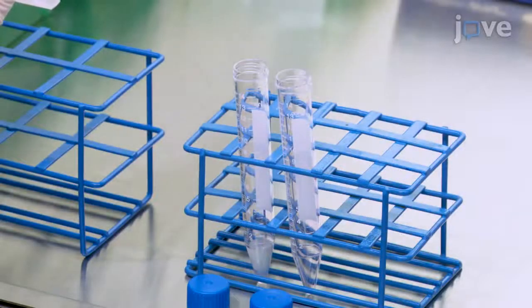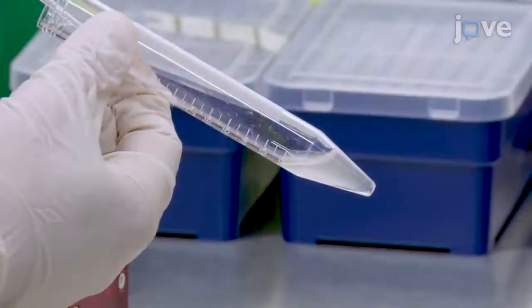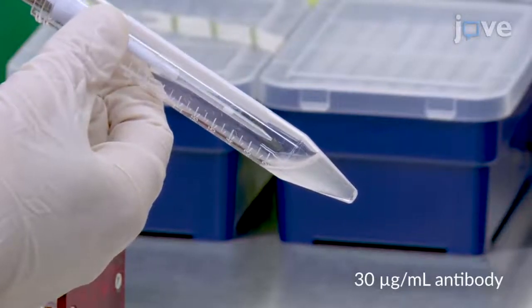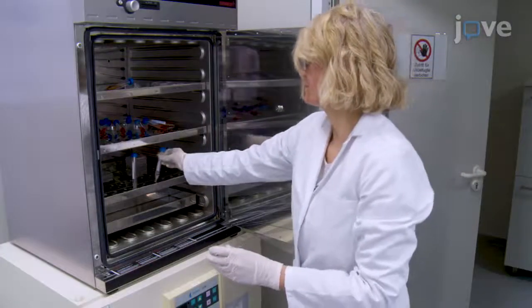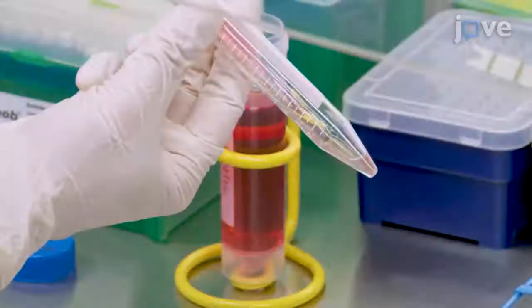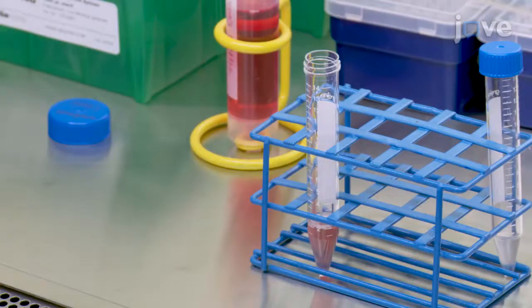Add 6 × 10^6 mononuclear cells to a 15 milliliter tube, then perform antibody cross-linking by adding human GPI-linked membrane protein-specific antibody to the cells in PBS with 1% BSA, and incubate for 30 minutes at 37 degrees Celsius. After the cross-linking, replace the incubation medium with ISCOV's Modified Dulbecco's Medium supplemented with 10% FBS, and grow the cells in a 15 milliliter polystyrene tube.